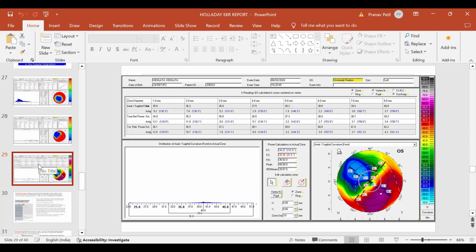But the problem which I encountered in most of the patients was that the pre-op autoref values varied at each visit so significantly that I was not able to get a good baseline to compare with, and also a good baseline for the post-op values. So how do we determine that? In pre-op RK patients, the auto values will be haywire anyway, so we can't trust them at all.